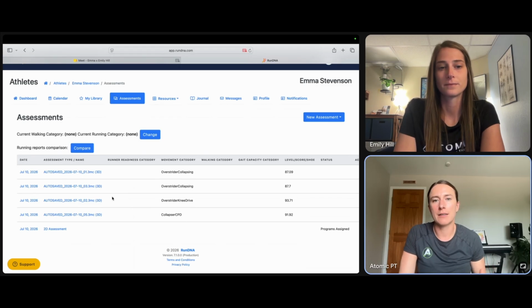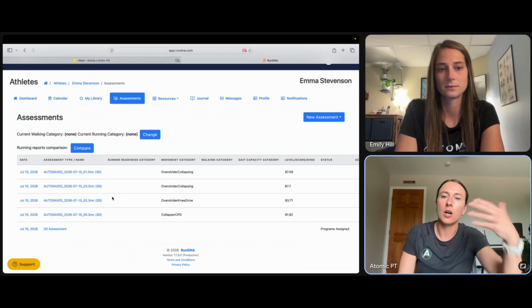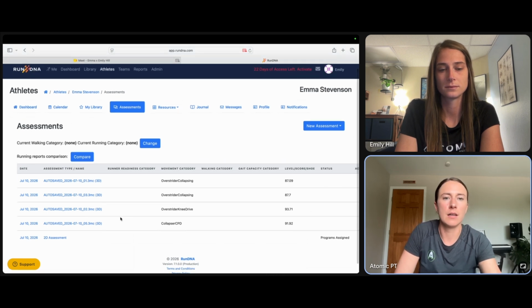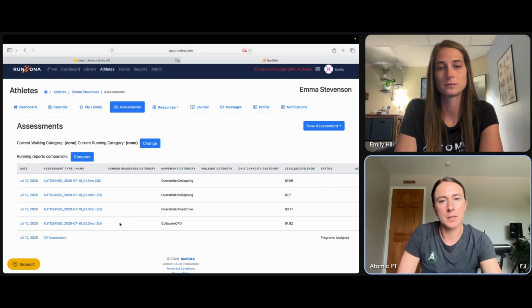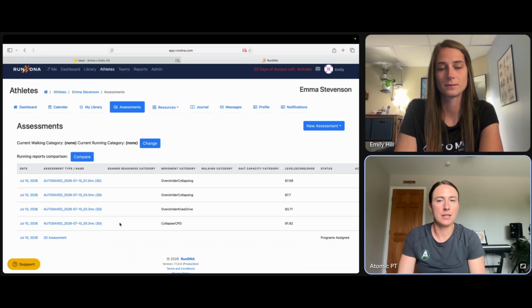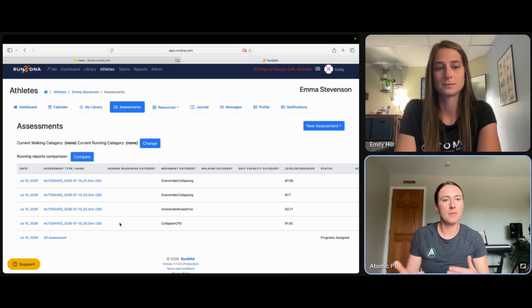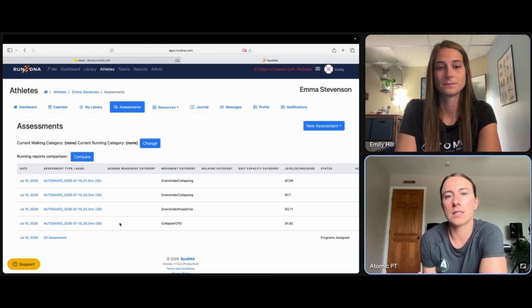And so we're able to even just in session get a better idea of how much work is going to go into fixing this run long term. And then we can come back in a couple of weeks and recheck and see that we're making progress based on what you've prescribed me. So it's a nice way to combine all of this awesome information and knowledge and all these drills, and then really be able to make sure they're actually working. And if they're not, we can address it quicker and make some changes. So that was also really cool to see.